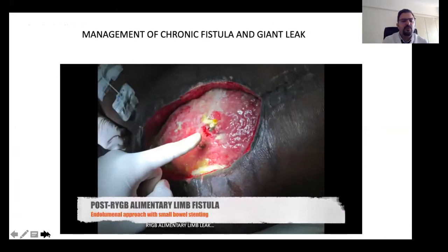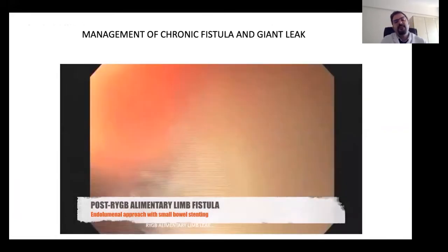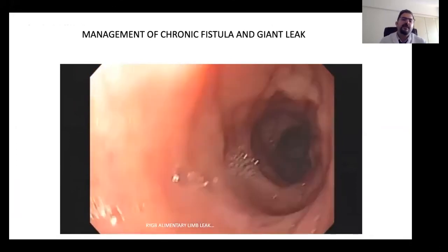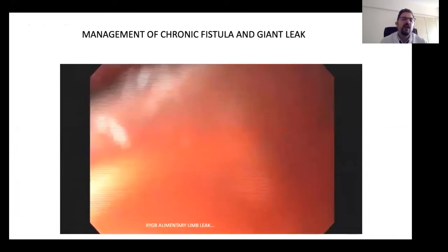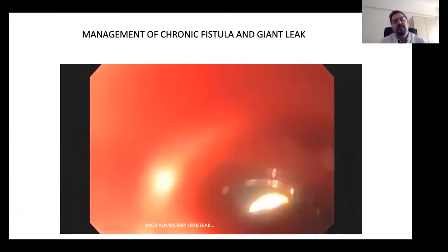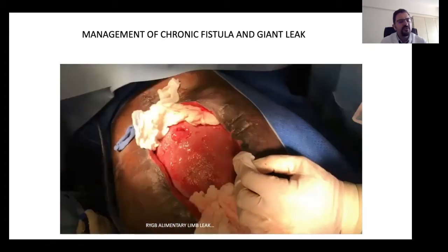Here you see how the fistula can become an enteral fistula, and the abdomen is open. And these are all mechanical things. So these are staplers, and you have to use these staplers wisely. But even if a leak happens, you have to know how to manage it, how to know the algorithm to do that. If you know the scientific methodology, the algorithm, then you'll be a successful surgeon, because then you will use all these techniques to save the patient's life.